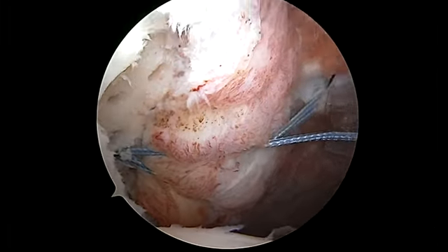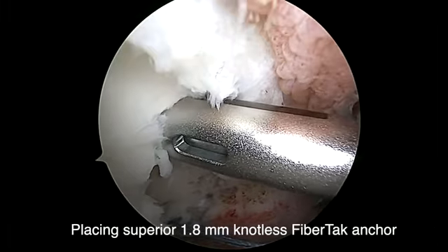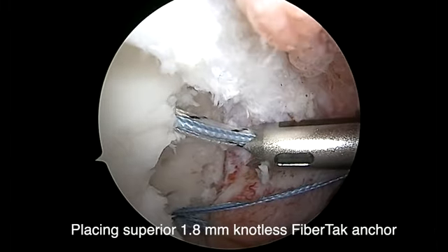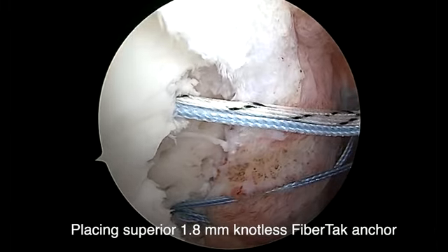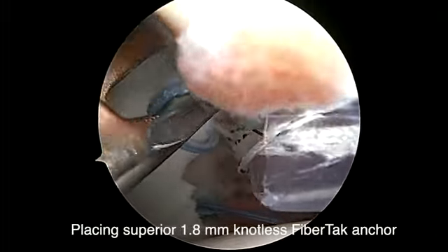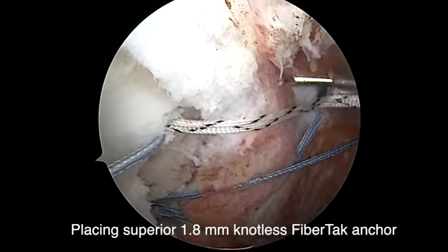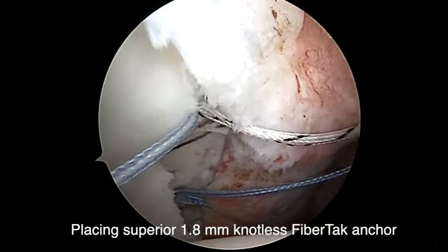A second 1.8 mm knotless fiber tack anchor is then drilled into the superior aspect of the glenoid defect. A suture lasso is again passed through the capsulolabral tissue and the repair stitch is shuttled through the anchor in a similar fashion to the inferior anchor and provisionally tensioned.